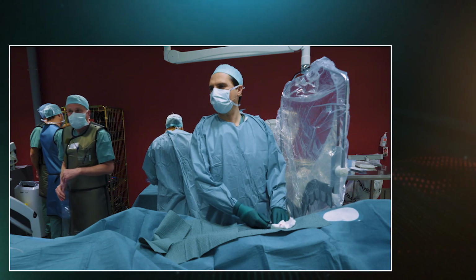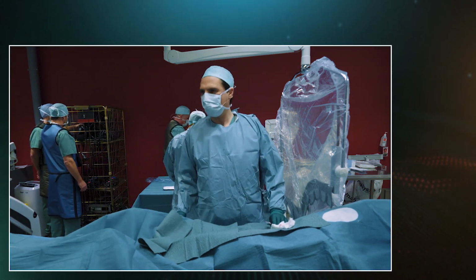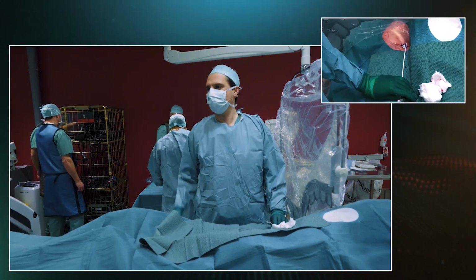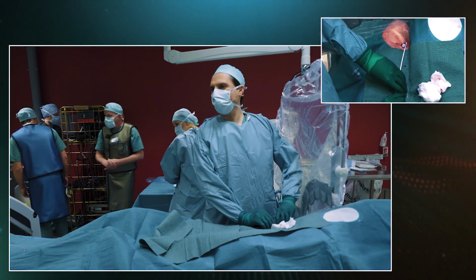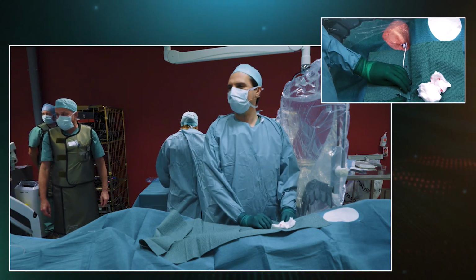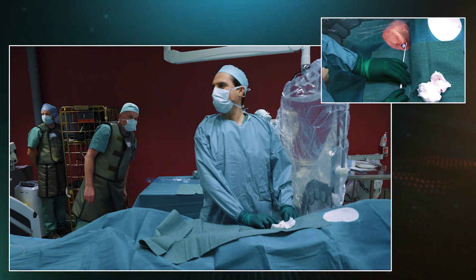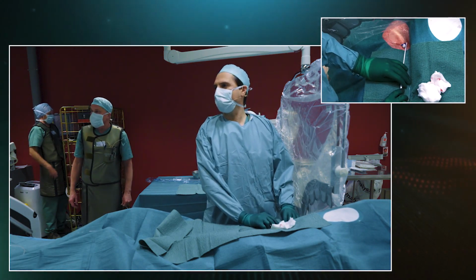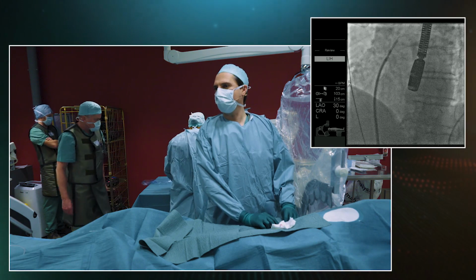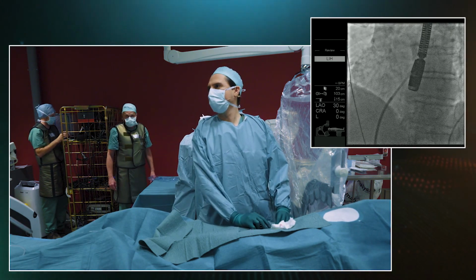So we did the vascular access. We're ready to start the procedure. So, a relatively young man with paroxysmal atrial fibrillation. We have 2 sheaths in the groin and we will do a single transseptal puncture. We moved to single transseptal puncture a few years ago because it's of course much easier, provided that we are reasonably certain that we will isolate the vein on the first attempt.